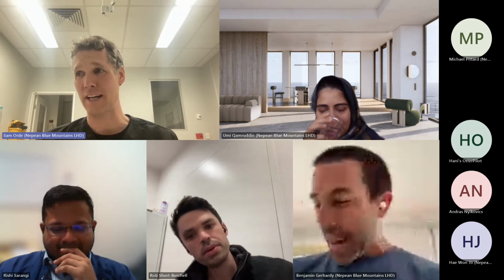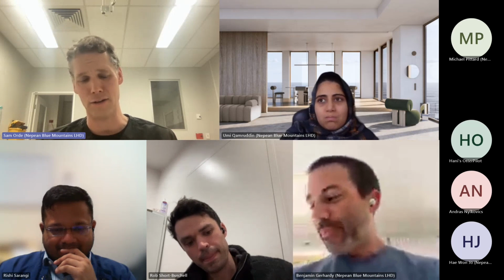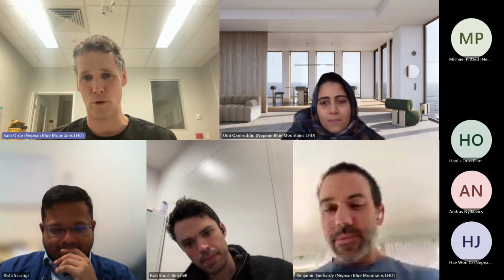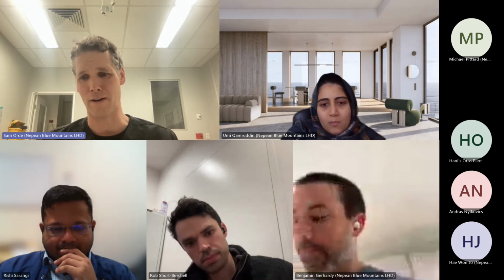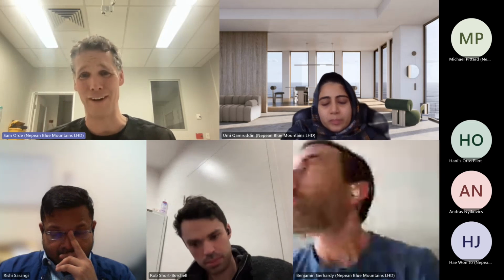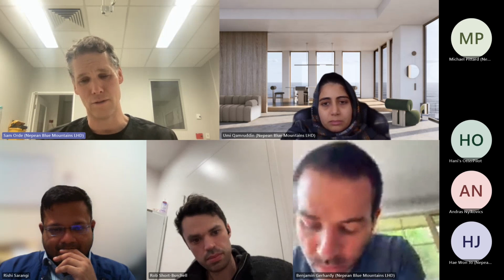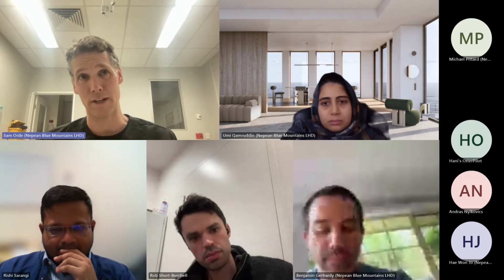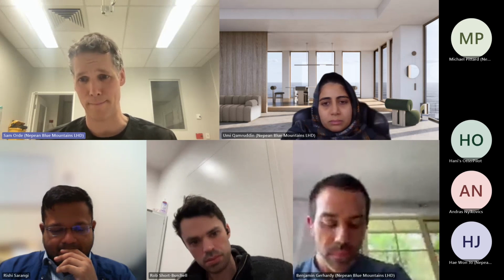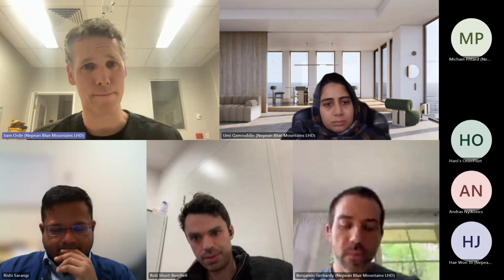In a critically ill patient that I'm caring for, I don't often do it, for all the reasons you just said. It's not always easy seeing that anterior wall in the two chamber, and trying to find the myocardium is a bit hard. If I'm doing contrast, I'll do it, because then it's super easy and you can do it really fast. So it's not a standard part of my day-to-day management of critically ill patients, but it is for the echo lab. Ben, sorry, I cut you off there.